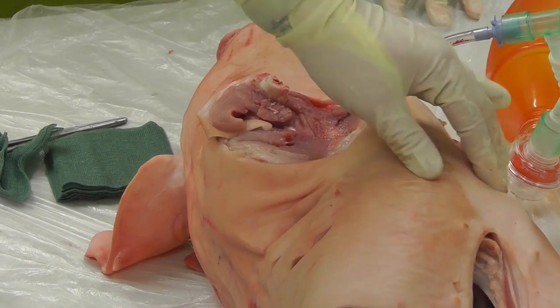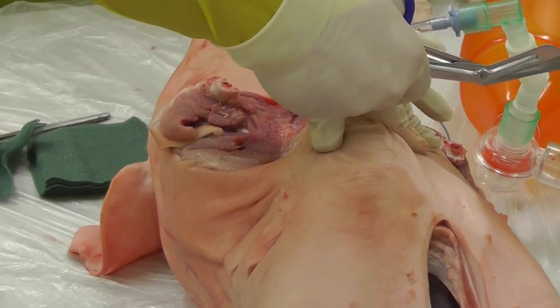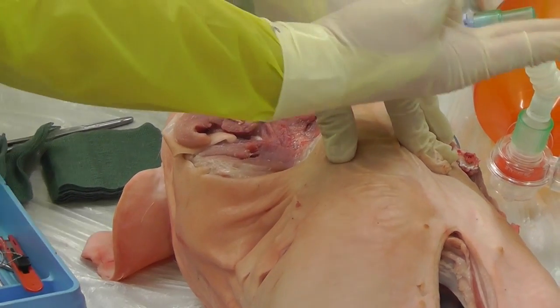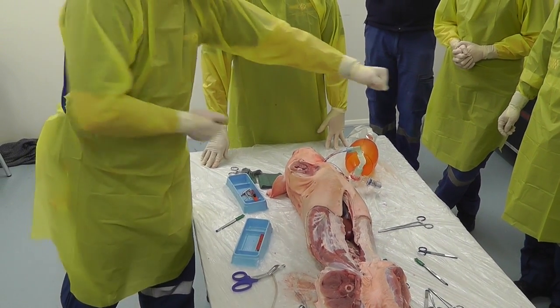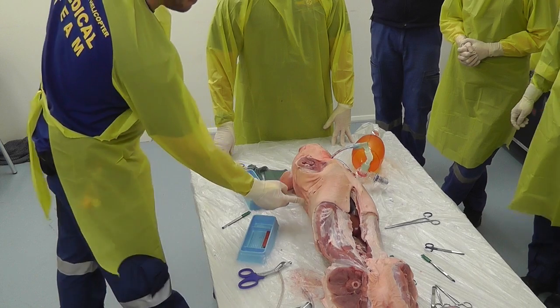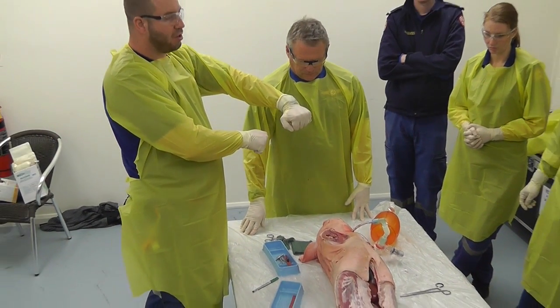When you divide that sternum, some sternums are going to be very tough and you are not going to be able to get through with tough cuts. You are going to need your gigli saw — forceps underneath, grab that cobra as we talked about before, pull it through. Don't let it touch your fingers or gloves. Divide the sternum and make sure your finger thoracostomies are very posterior because it gives that clamshell as much exposure as possible.